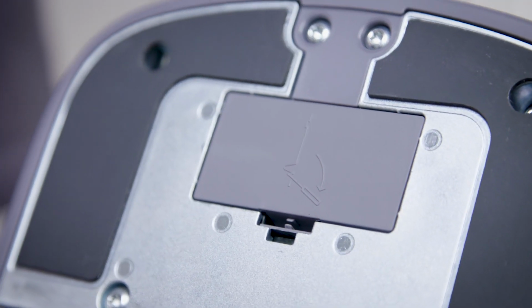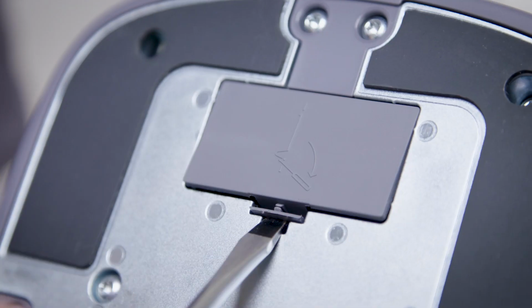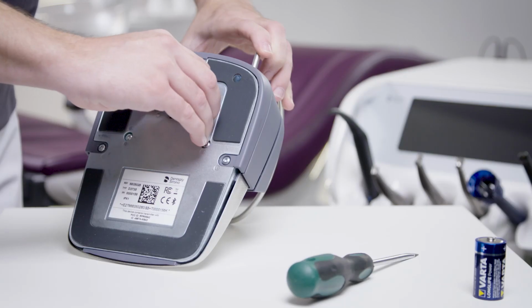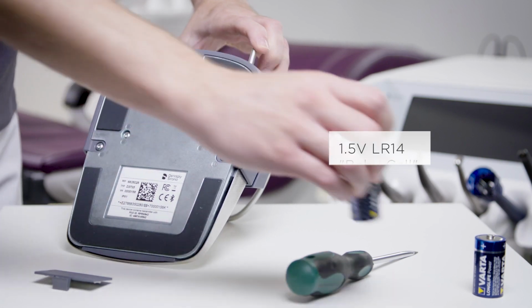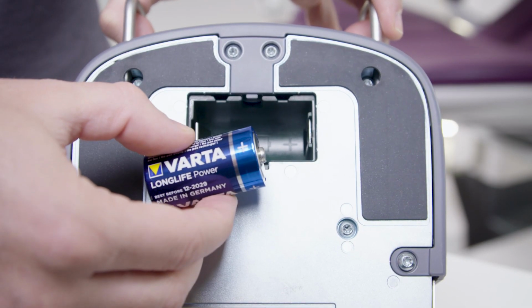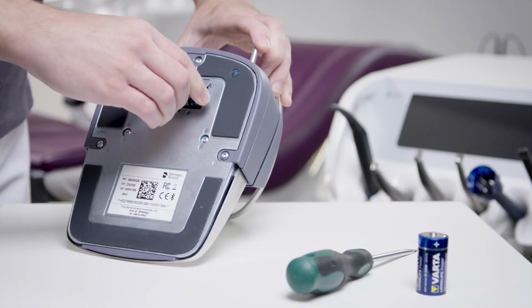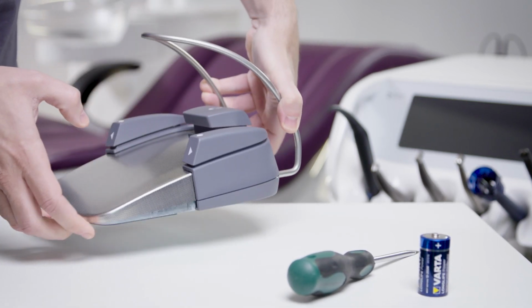The battery compartment is on the bottom of the Smart Control. Open the battery cover using a screwdriver, for example. Replace the battery, ensuring correct polarity. Now close the battery compartment. You can then check the battery level once again.